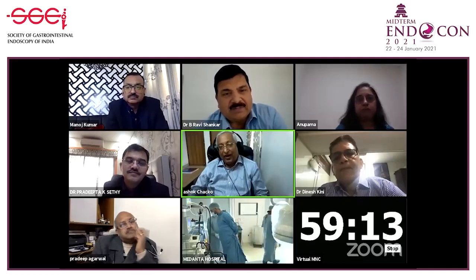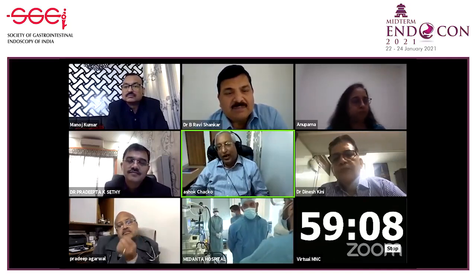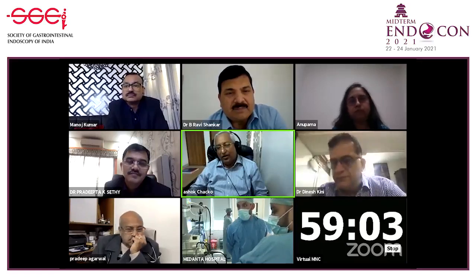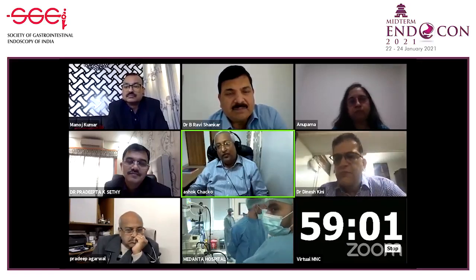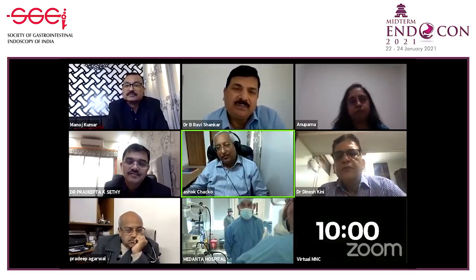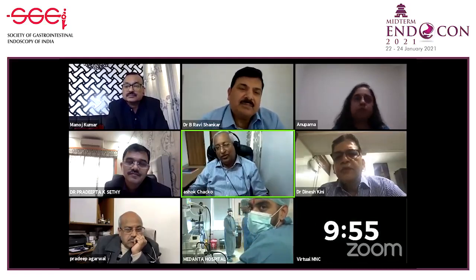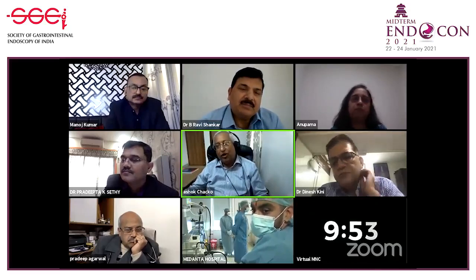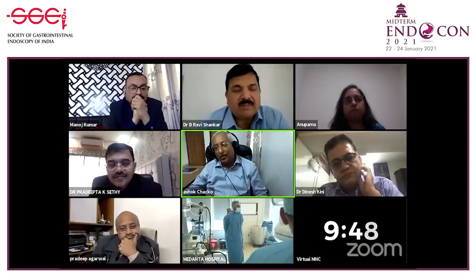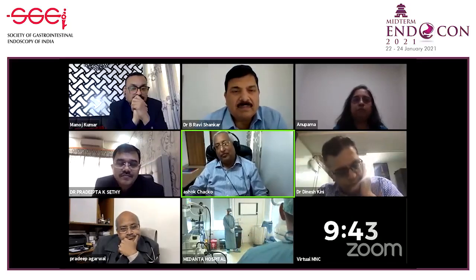We haven't done any study in our unit, but there are ample studies of nurses looking at the pictures, noting down areas which they think are abnormal, and then the doctor reading. When I was in CMC as well as in Madras Medical Mission, our technician used to initially go through the study and select areas which he thought were abnormal. Then the doctor would go through and check the technician's findings as well as run through. This definitely saved time.